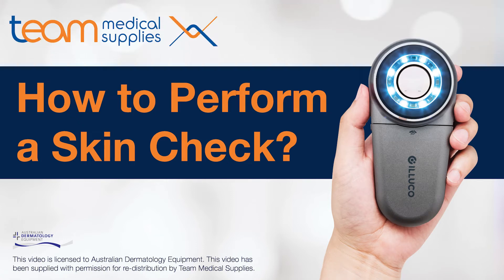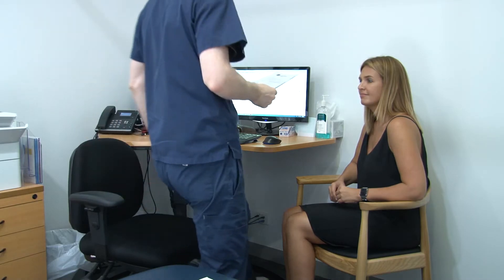There are lots of ways to do a skin check. Whichever way you choose, it should be thorough, it should be repeatable, and should be flexible because some patients sort of tie your hand behind your back somewhat with their requirements for modesty. Some don't, some do.